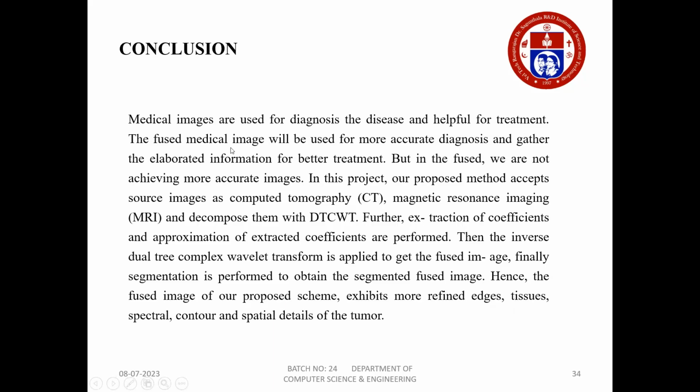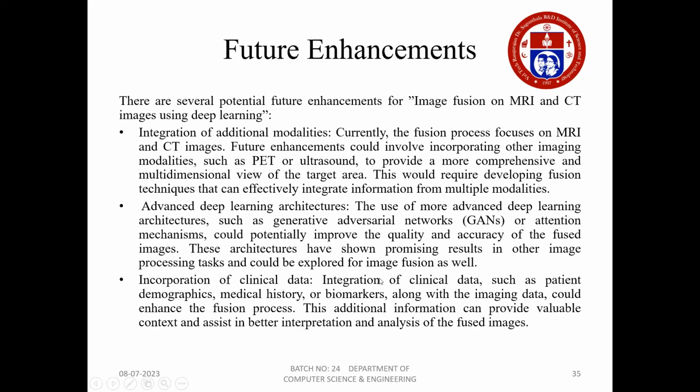Coming to the conclusion, medical images are used for diagnosis. Through MR and CT images, magnetic resonance, and by using DTCWT for processing, extraction of coefficients and approximation of the extracted coefficients are performed, and the inverse dual-tree complex wavelet transform is applied to obtain the fusion image. Finally, segmentation is performed to obtain the segmented image.